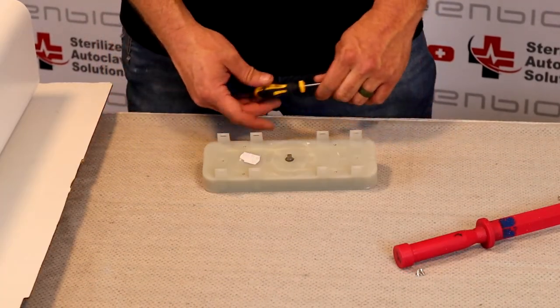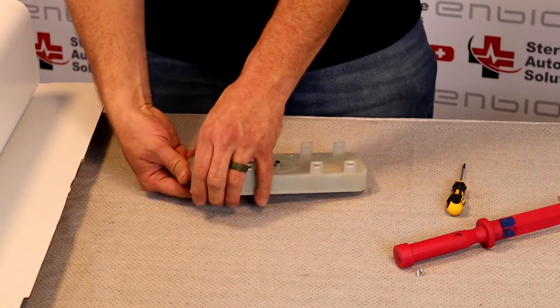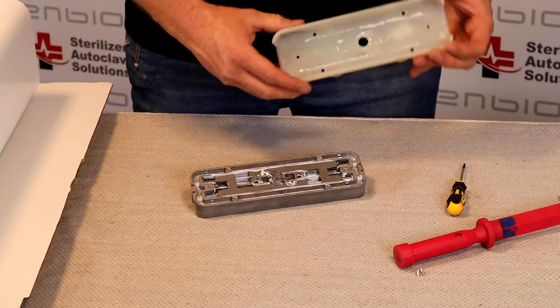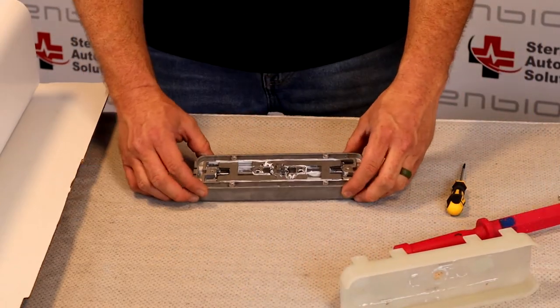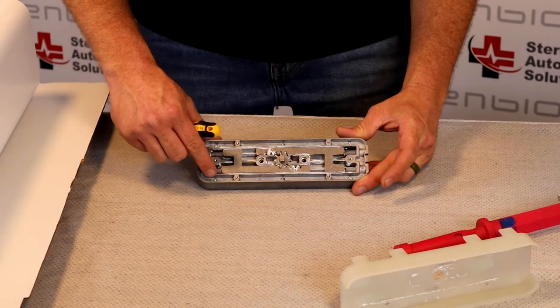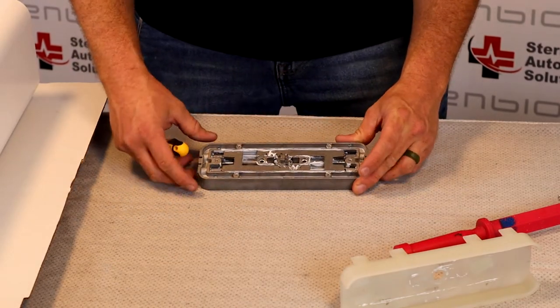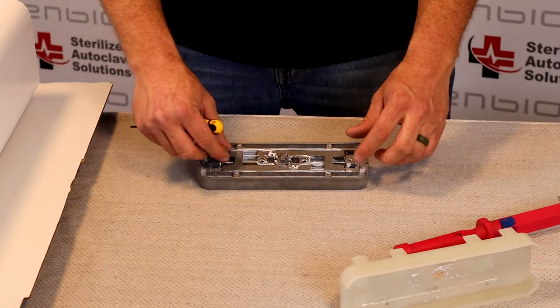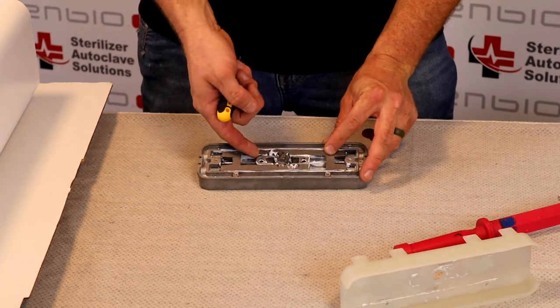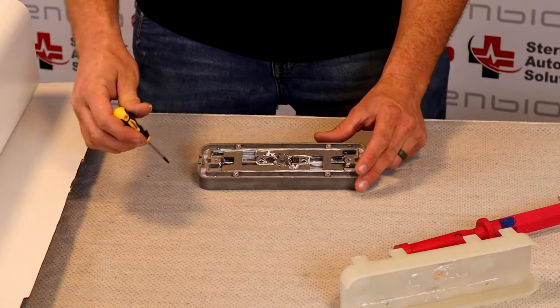Now that all six screws are removed, we are going to separate the plastic from the metal base. There are four more screws on the inside in all four corners. You want to be careful not to flip this upside down because the inner workings and gear are free-floating without this plastic cover.